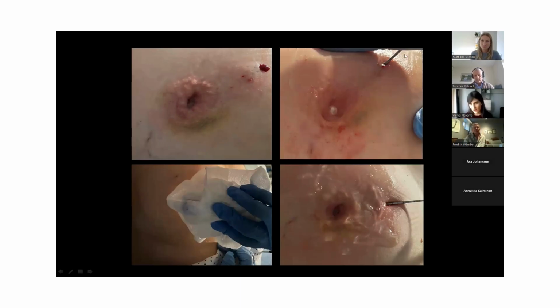So here we have the cryo needle. This is the white area where we are freezing directly the nipple, but we want this because the papilloma is located here, so we want to destroy it. As we have seen before with the skin lesions, we have to hold on this for a little bit. Then we use the hot saline back, and after a while, the nipple recovers its normal color again. You see, almost like before the procedure.